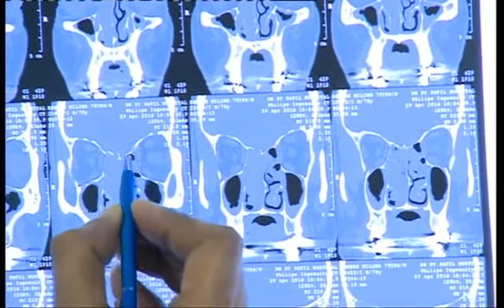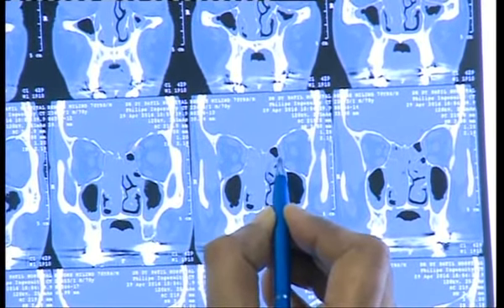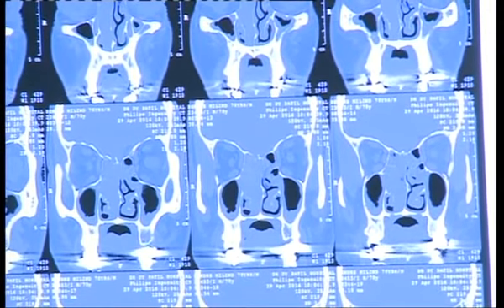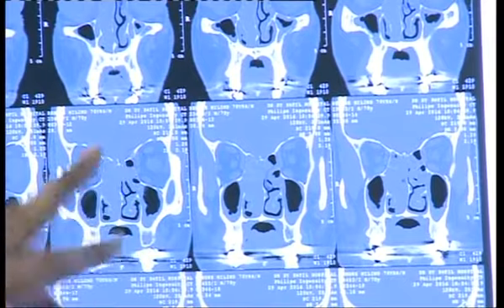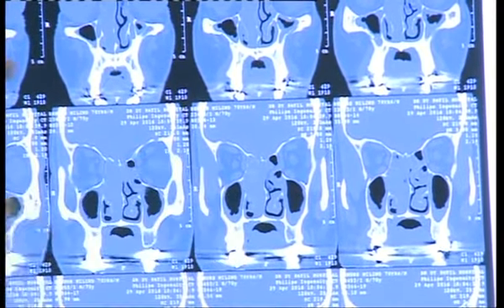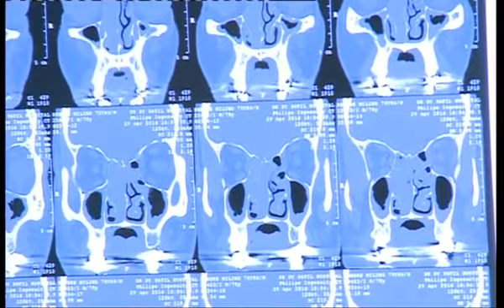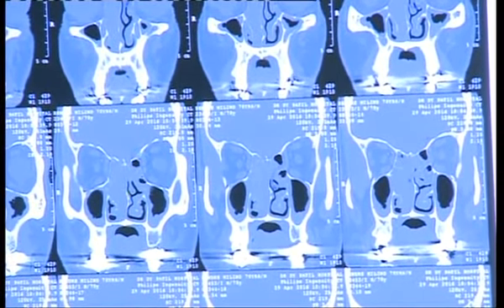The moment you see the anterior ethmoidal artery, what you see in the next scan is the ground lamella. So clinically, when you see the ground lamella and where it is attached up onto the skull base, the anterior ethmoidal artery is almost always immediately anterior to it. You can identify the artery in many ways, coming from the anterior like the frontal sinus ostium, then one cell like the fovea or the supraorbital recess, and immediately behind is the artery.